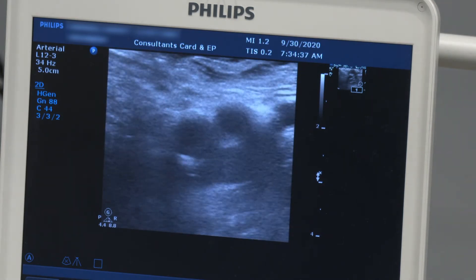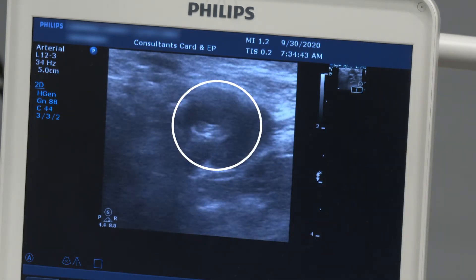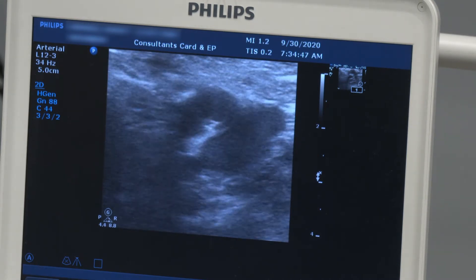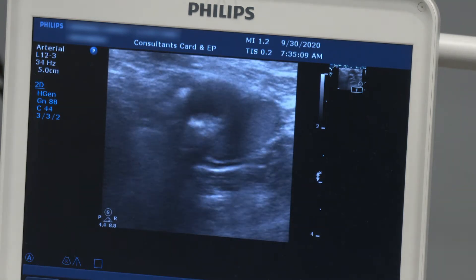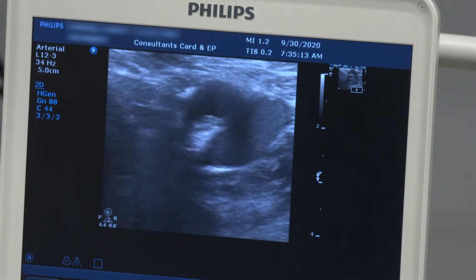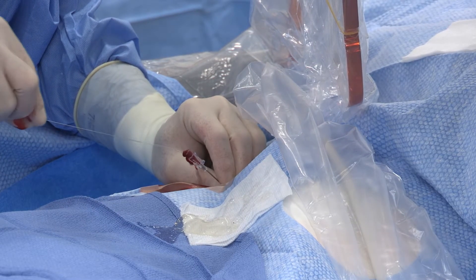Again, you see the profunda and the superficial femoral artery. I move my probe up a little bit and I'm going to engage the anterior wall of the common femoral artery, in the middle of the sheath. My needle is advancing and I enter the anterior wall of the femoral artery. Once I have flow, I remove my probe and advance my wire.